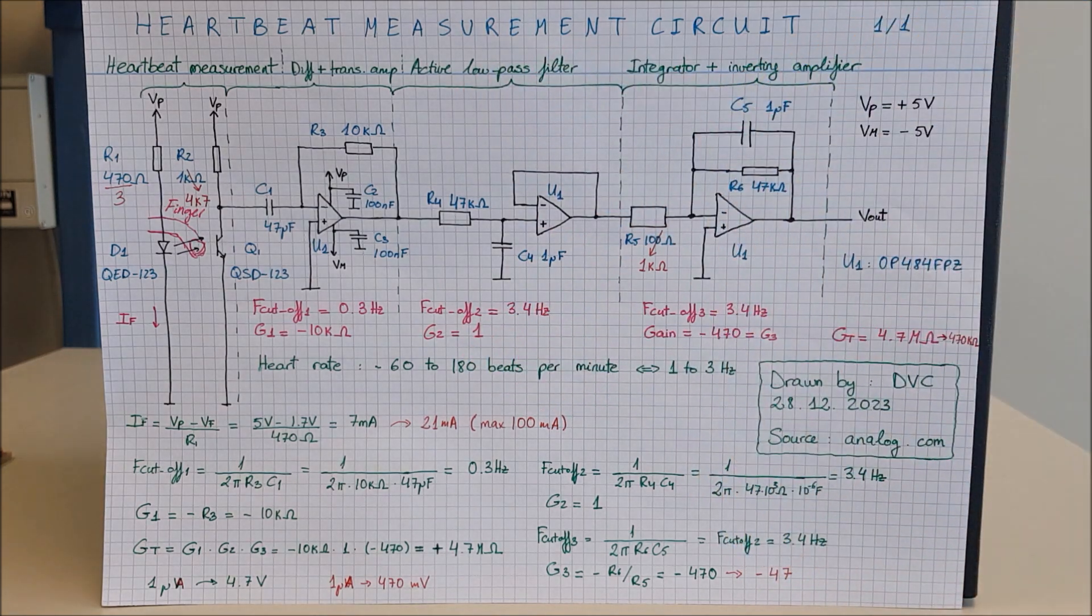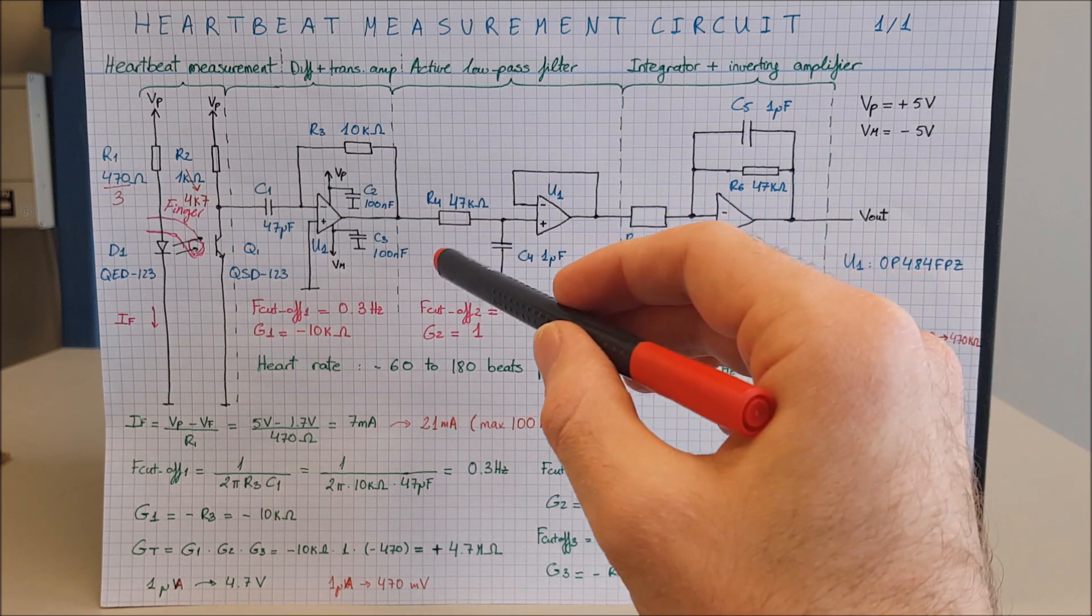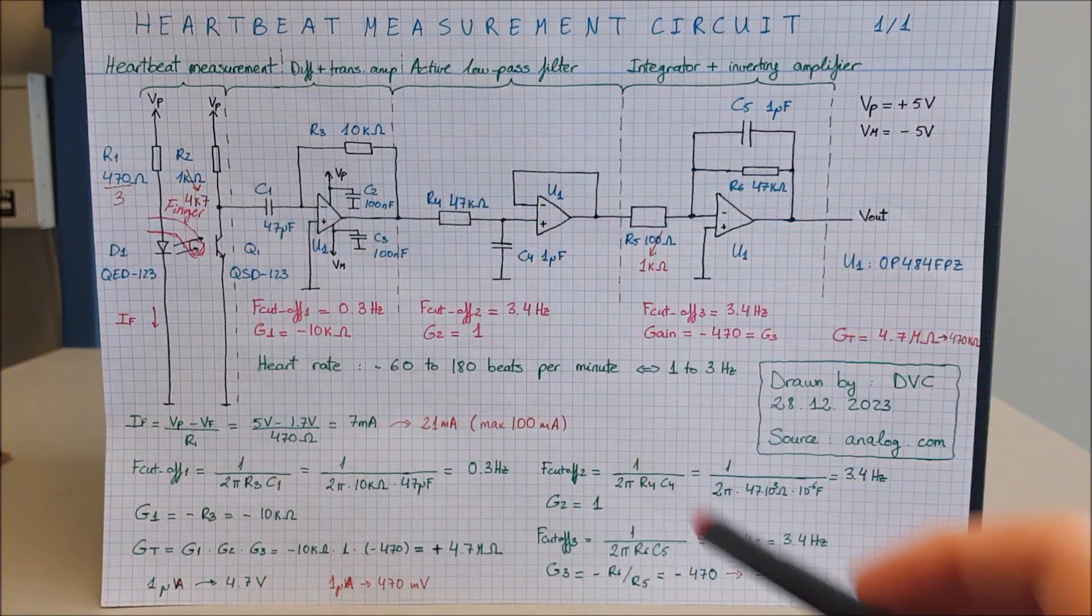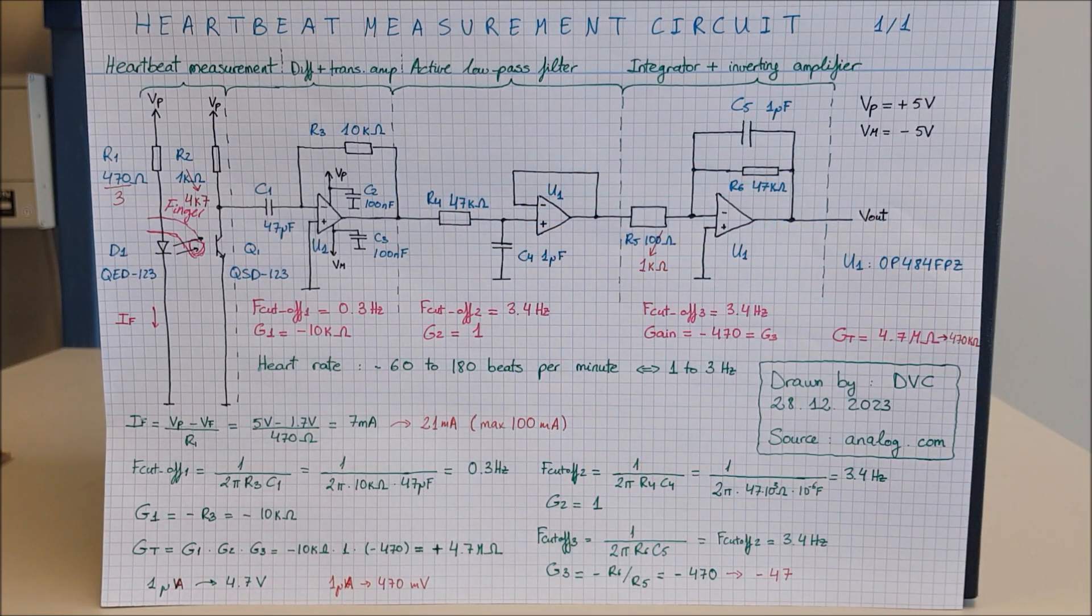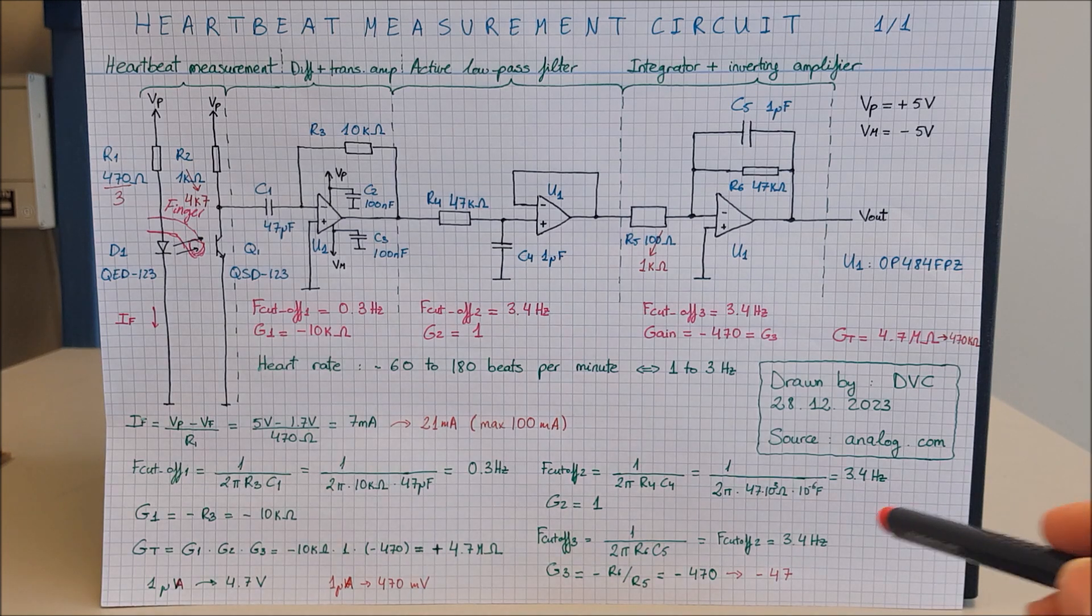I have an active low-pass filter. We don't want signals with frequencies higher than 3 Hertz, so we want to get rid of those. That is the purpose of capacitor C4. The cutoff frequency is 1 divided by 2 pi R4 times C4, which is 3.4 Hertz. Signals with frequency higher than 3.4 Hertz will be cut off.